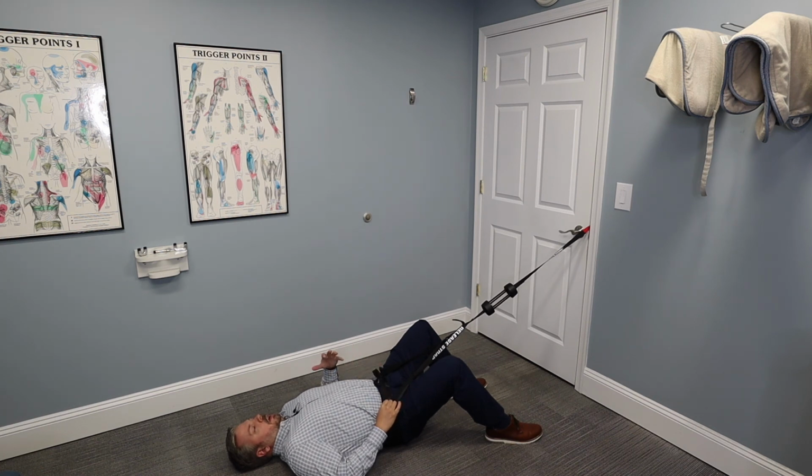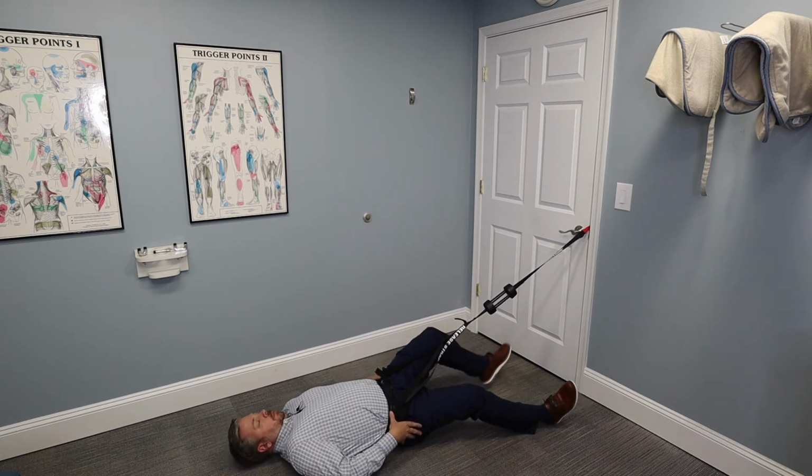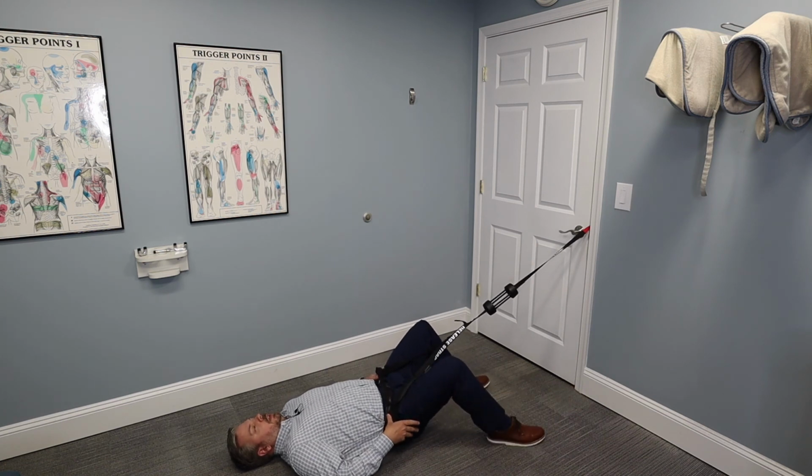Typically I would recommend ideally holding the stretch for 45 seconds and then relaxing for 30. And you just do that for about 15 to 20 minutes. It feels really good, just like a really good stretch in my lower back. Again, you can straighten your legs, but I personally feel like I get more of a stretch when I bring my legs up like that.